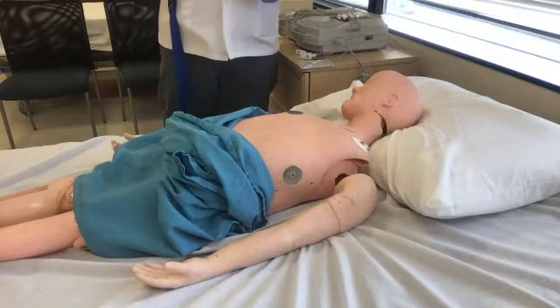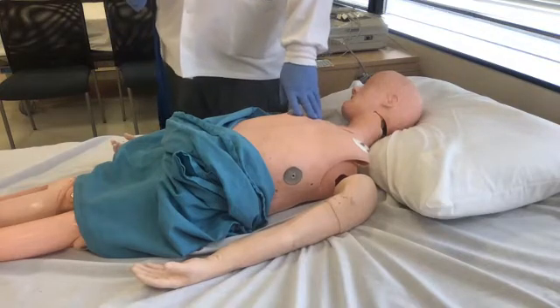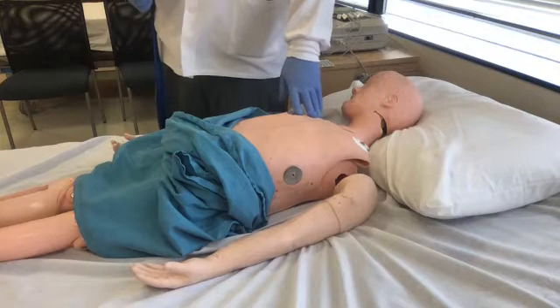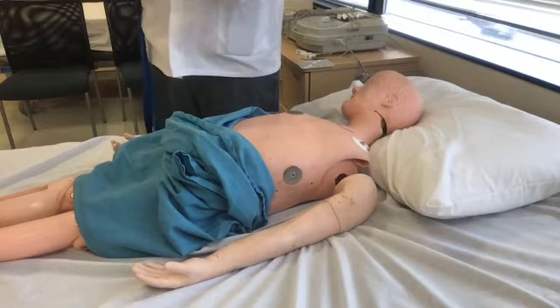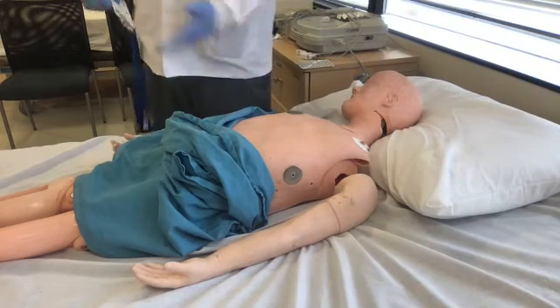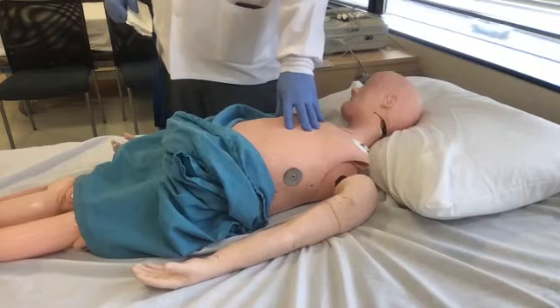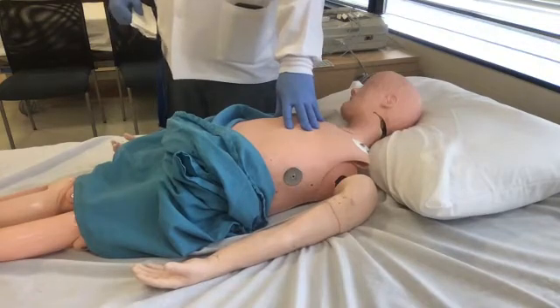And also, how many times, if you're doing this in the emergency room, there's blood. You got to take a sterile towel. I put NSS on it, normal saline. I just dump normal saline on that towel, and I just wipe as much as I can, because my ER doc needs those things up and running.